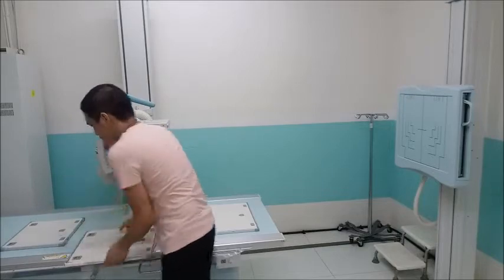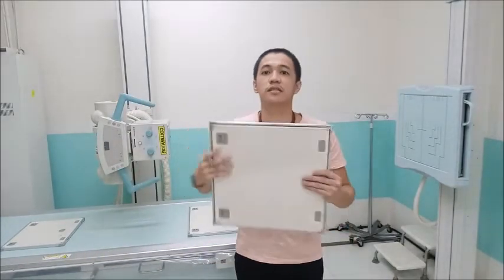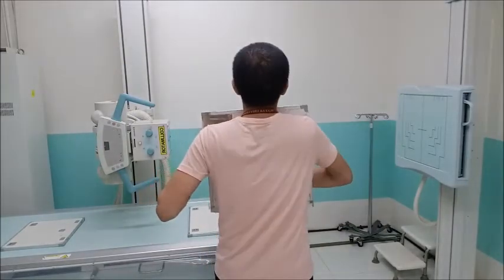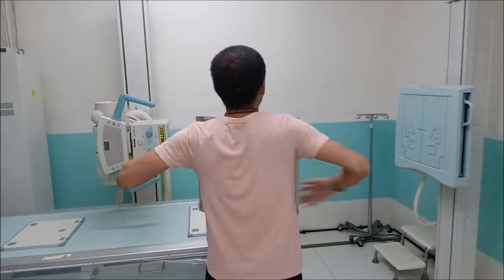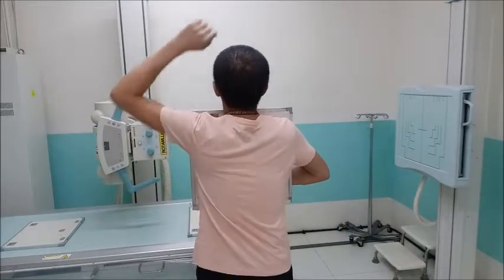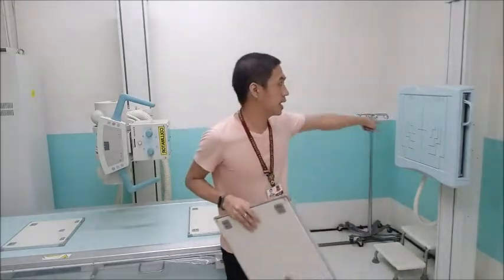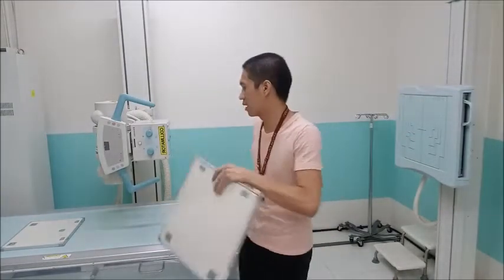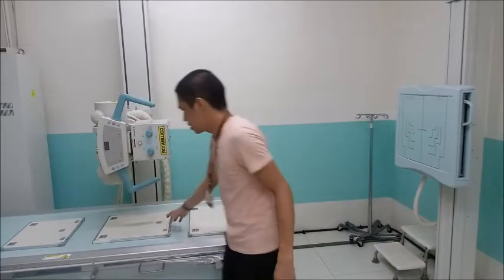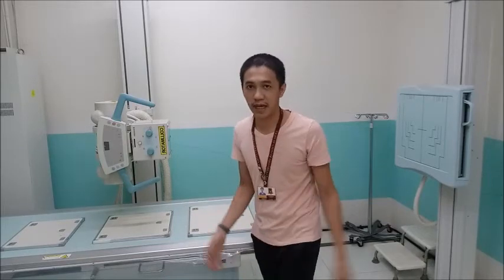So to be safe, so that nothing is cut off, the safest is to cover the whole thorax of the patient. And also, if you look at the back, you can still see some space towards the lateral portions. Okay? So take note, it is harder to see when you insert it in your chest stand, your chest bucky. Okay? So you have prepared the cassette, and then you also have to prepare the X-ray room.